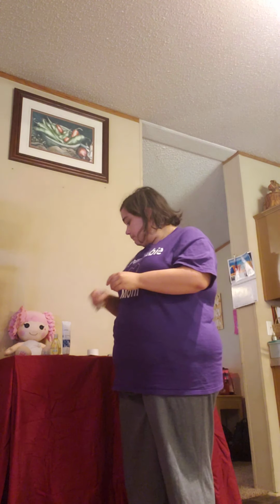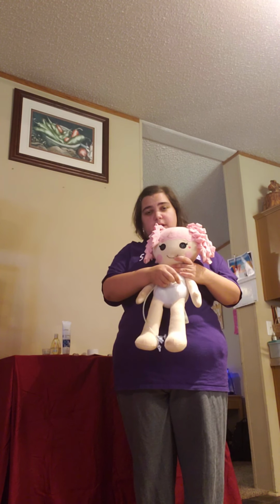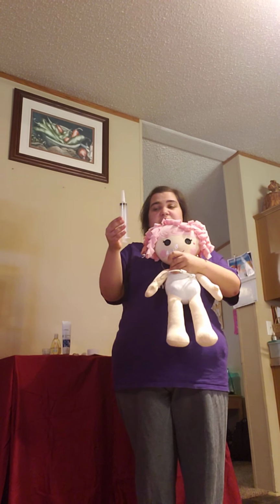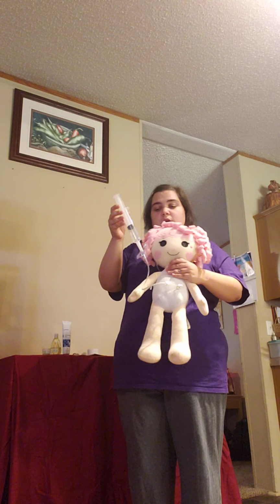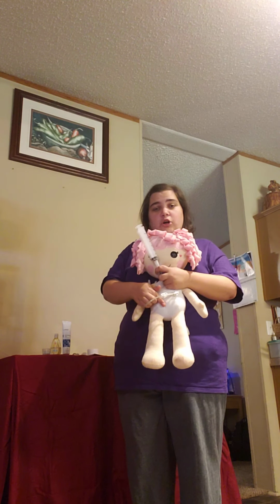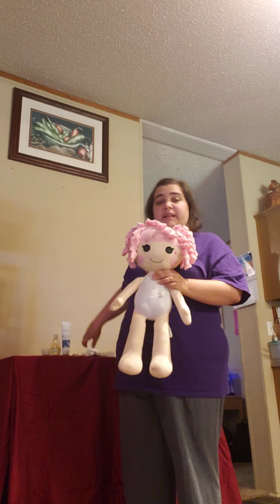There are 2 ways to check placement. First, you can attach your extension to the G button, and using your 60 mL syringe, pull out some stomach fluid. If you are able to pull out the stomach fluid, this ensures that the button is in the correct place. You may also check the button placement by putting a stethoscope on the stomach and inserting a small amount of air into the tube. When that air hits the belly, you will hear a belly grumble, ensuring that the button is in the correct place.